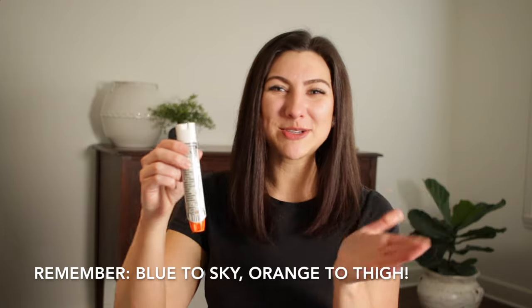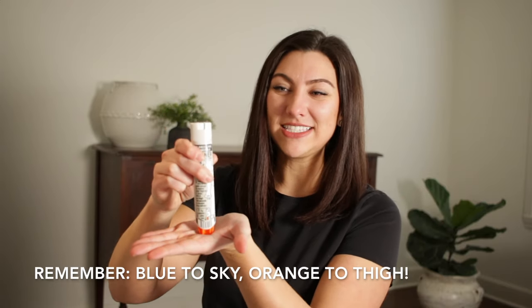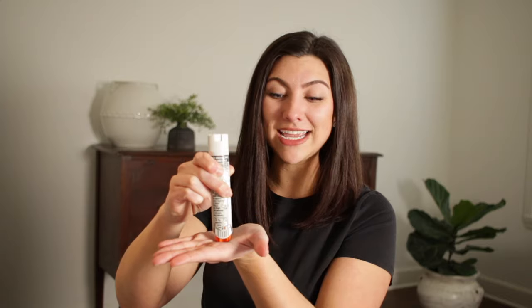You would never do this in real life, but so you can see, I will show you on my hand. As you press down, the medication goes in — you hear it click. You'll wait 10 seconds to make sure all of the medication goes in. You'll know the medication has been administered because hopefully your patient starts to improve, and also the needle will slide down.